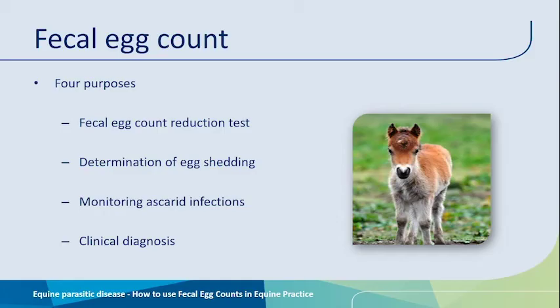So when we discuss the utility and usefulness of fecal egg counts in equine practice, we have to really define what we are going to use the egg counts for. And I usually delineate between the 4 different applications that you see here on the screen. And in this presentation, we're going to discuss these separately.